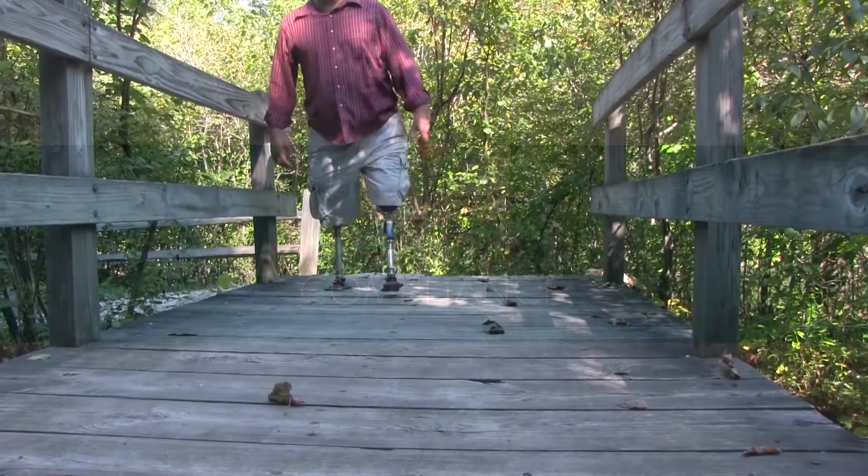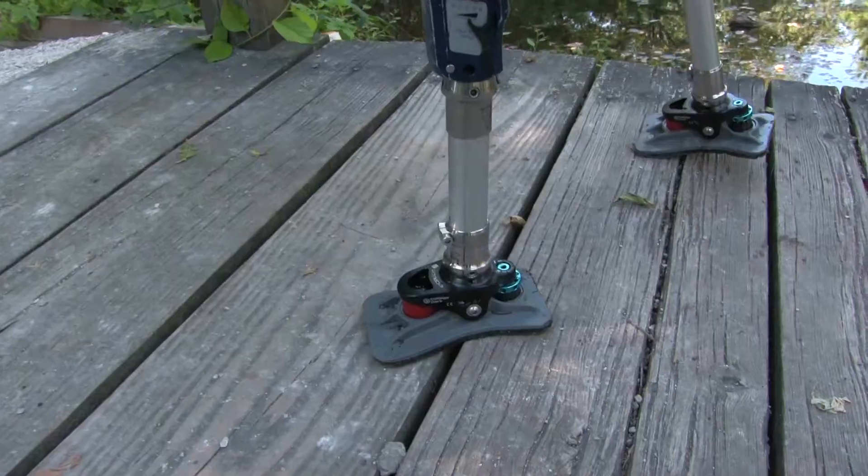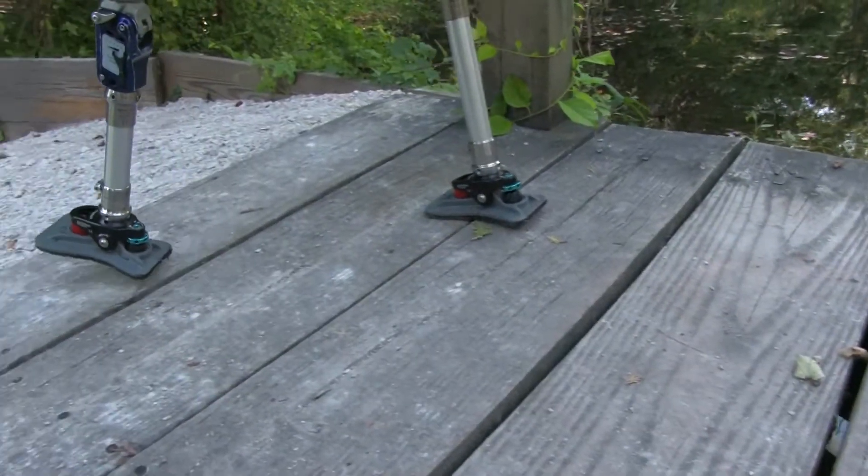The multi-axial ankle, flexible platform, adjustable bumpers, and molded tread all work together for unparalleled ground compliance in any environment.